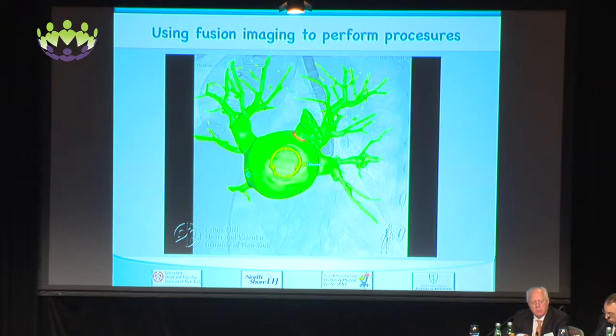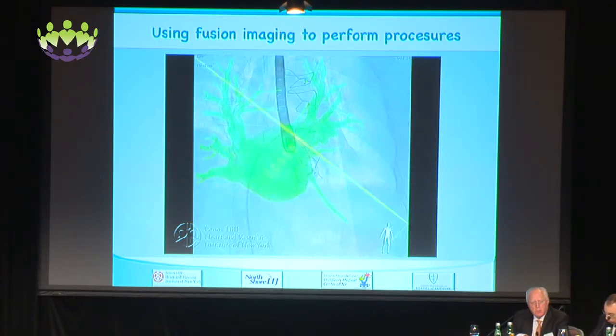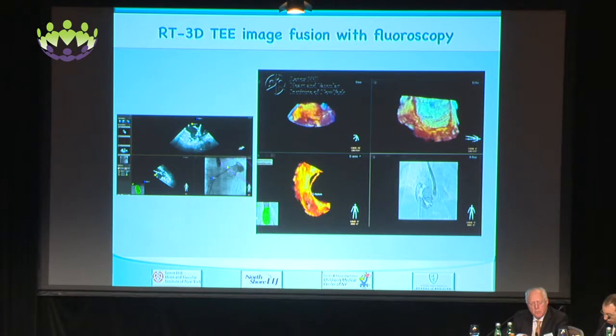Based on that, we can then bring that into the Cath lab and overlay those images using fusion imaging from the pre-acquired CT onto the fluoroscopy, and that will guide us very accurately without having to guess whether it's a chicken wing or a windsock. We know exactly where we're going, having analyzed those images from the 3D point of view. Now, we have something that is a problem, and I'll go over that: these images have been pre-acquired.